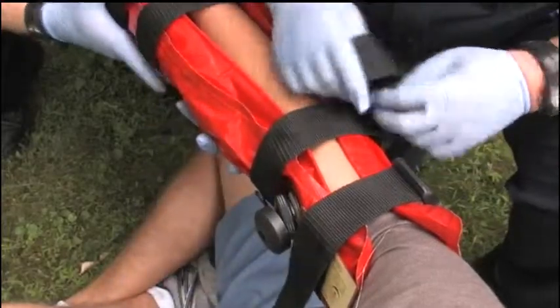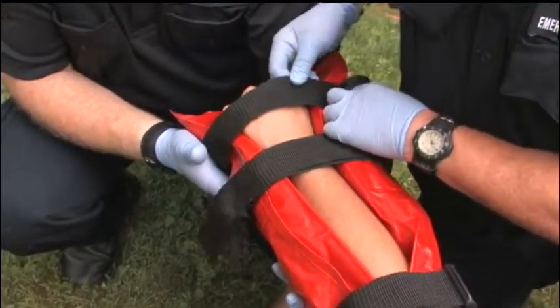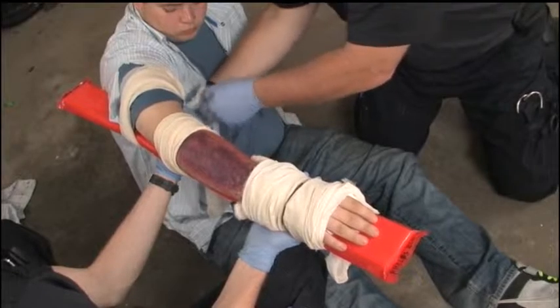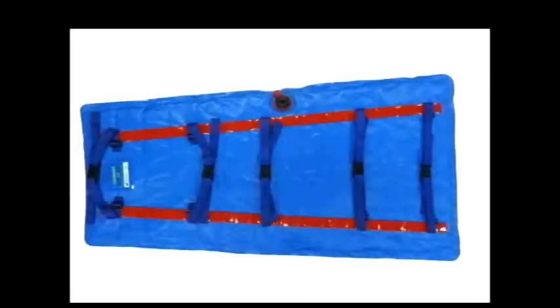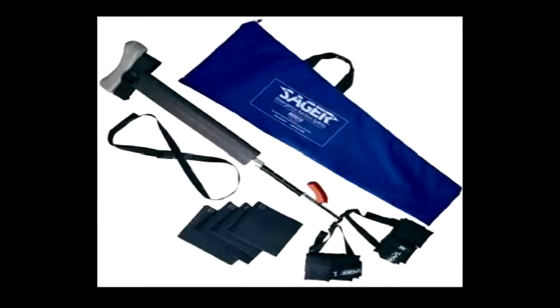Splinting the extremity immobilizes the limb and prevents further damage to soft tissue, nerves, blood vessels, and the bones themselves. Effective splints always immobilize the adjacent joints and bone ends. Many types of commercial splinting devices exist that are usually categorized as rigid, such as a cardboard splint, formable, such as ladder or vacuum splints, and traction, such as Hare or Sager splints. Traction splints are used specifically for femur fractures and will be addressed separately.